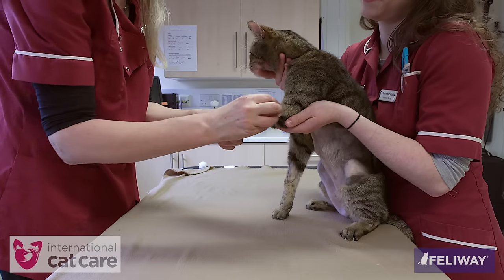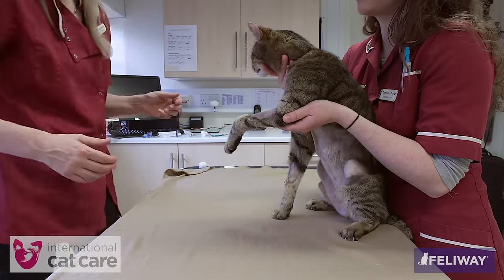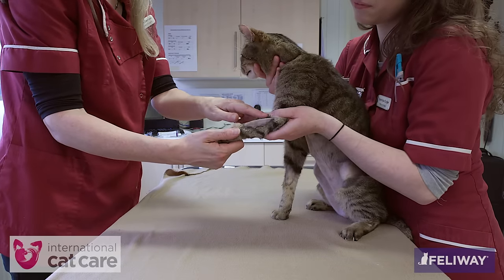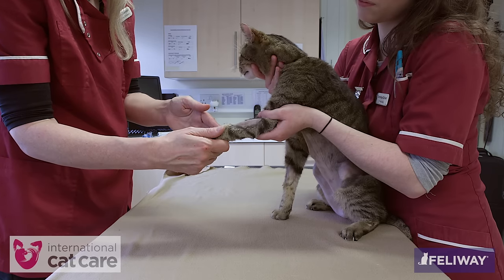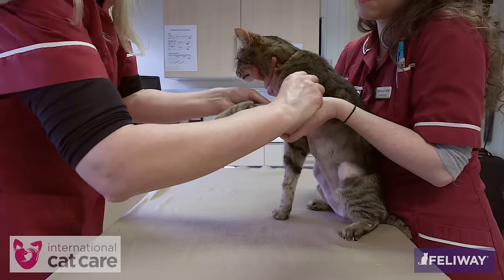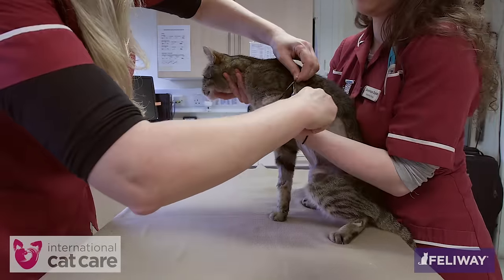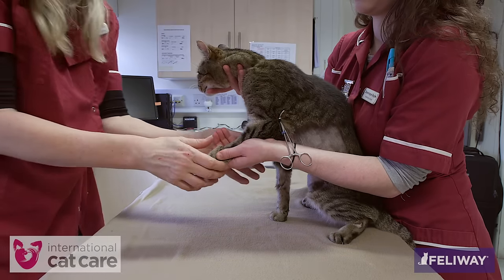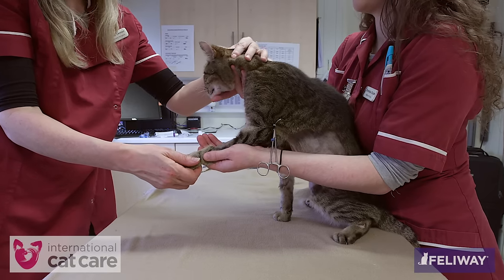When placing the catheter, the assistant should adopt a similar position to before. Here the cat is held against her, with a hand under the cat's chin, both restraining and stroking the cat. The assistant's other hand is used to gently extend the cat's elbow and raise the vein. Alternatively, a tourniquet can be used to raise the vein, or an elastic band clipped tight with forceps. Note the cat is held gently, constantly reassured, and it is sitting comfortably on a towel.